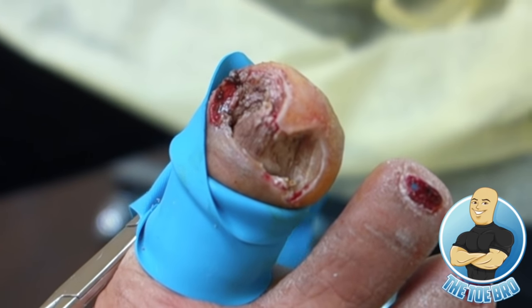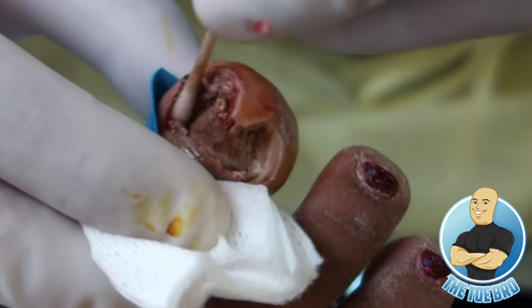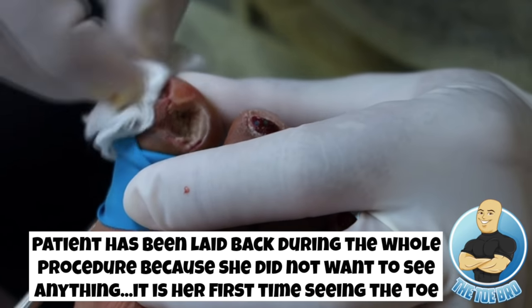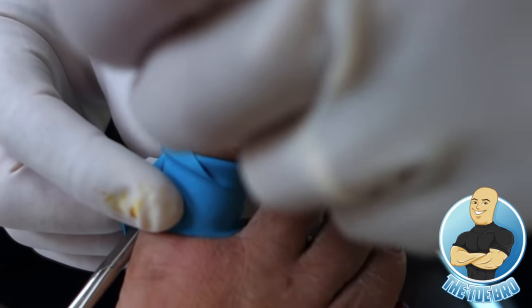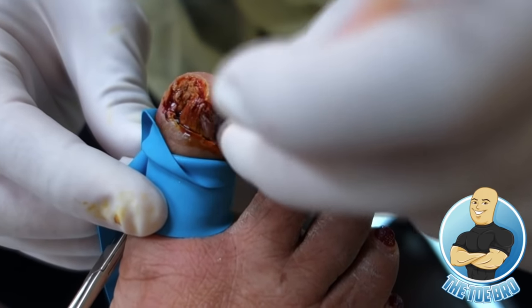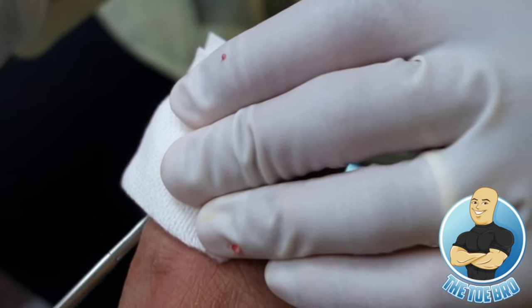Okay. All done, Tita. It did not rain, Anna? No. You want to see? Is the nail removed? Yep, nail's gone. How come it looked like... That's the nail bed. And then the wart removed? Mm-hmm. There we go. The wart's removed on the side. It did not grow. No more. So this will all become smooth. Smooth. And I will dress that tomorrow? Yes.